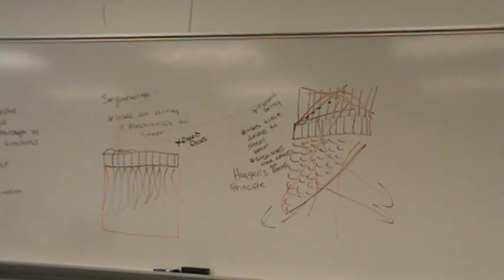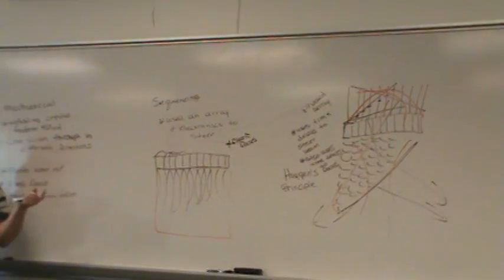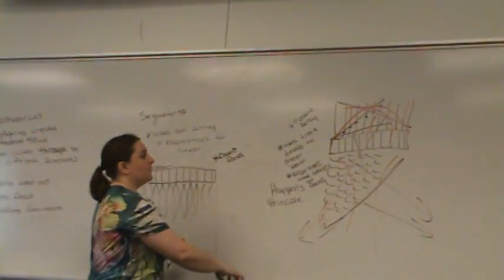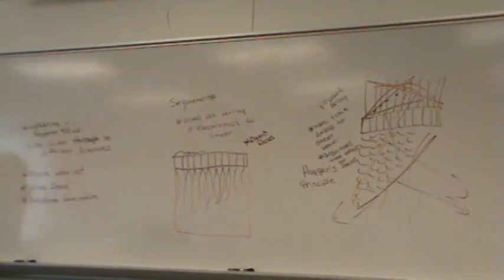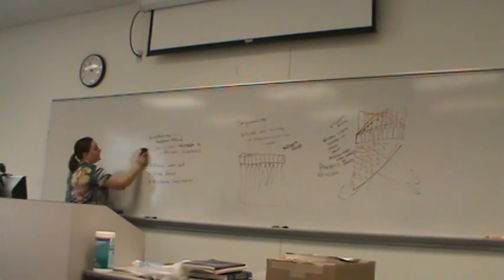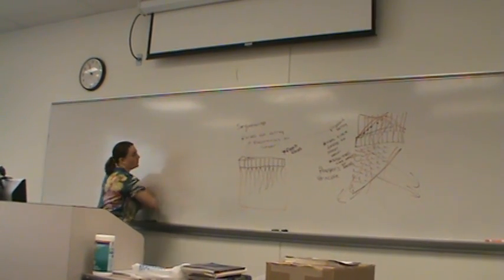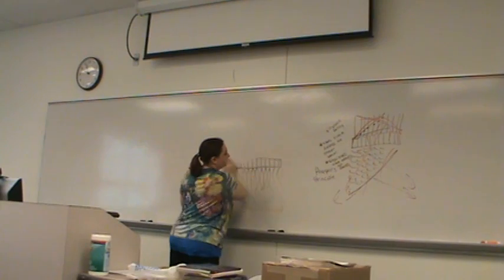Okay, so all of our transducers that we use today have some aspect of phasing to them. We have 3 main transducers that we really talk about and use up in the labs. We don't use mechanical transducers anymore. We don't use a transducer that just uses straight sequencing.